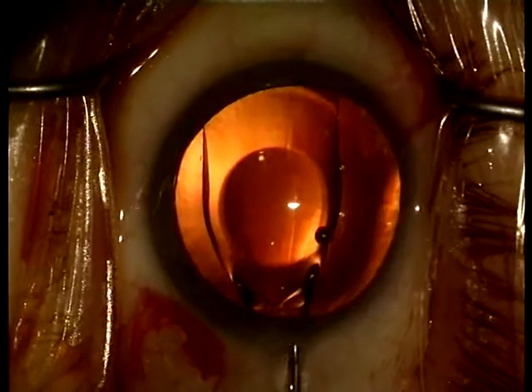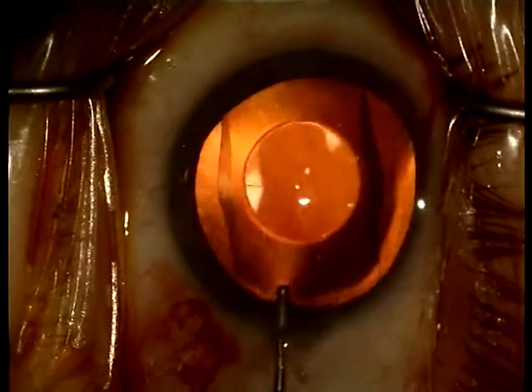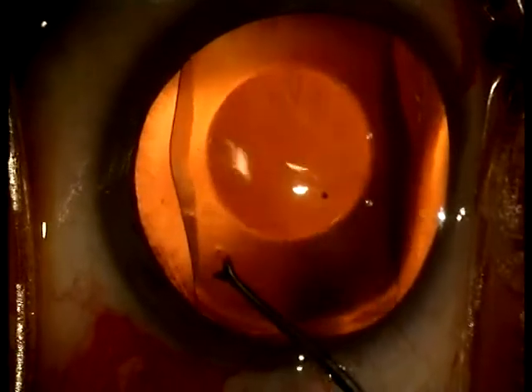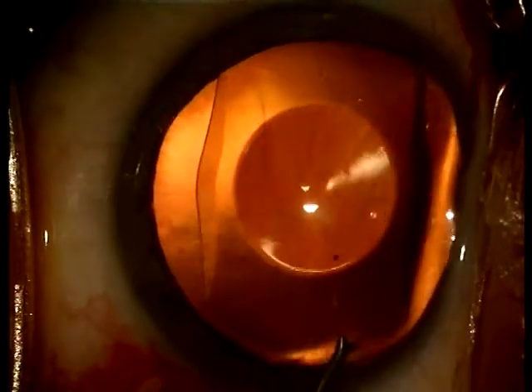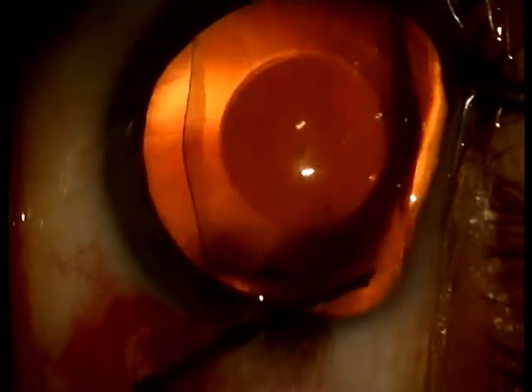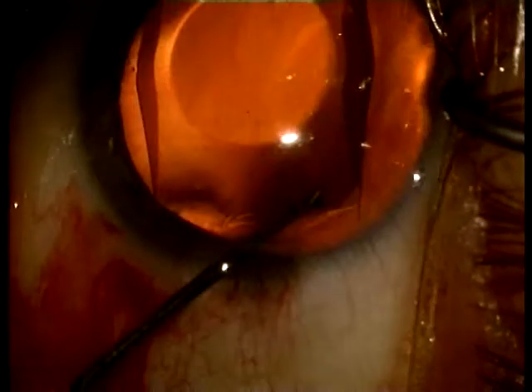To push the lens downwards, a little bit of methylcellulose is placed on top of the intraocular lens. With a toothed forceps and through the main incision, the proximal haptics are placed behind the iris. Make sure not to touch the optic part of the ICL because of the risk of touching the crystalline lens.